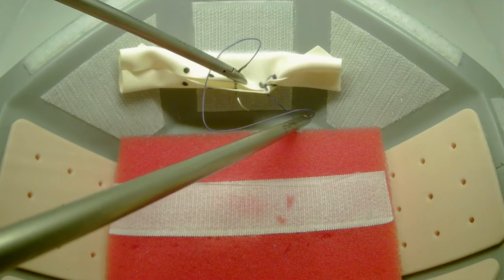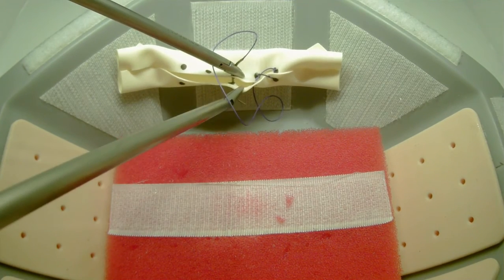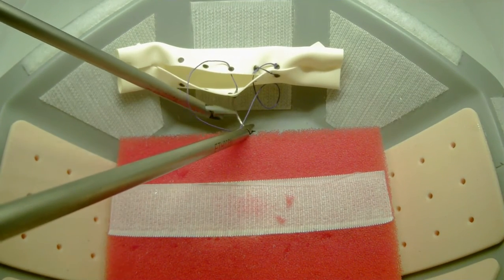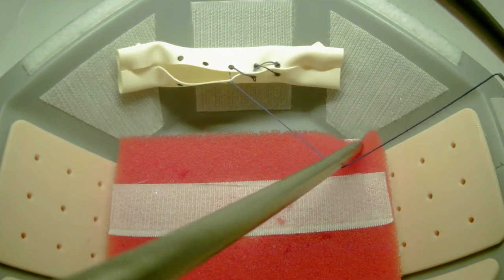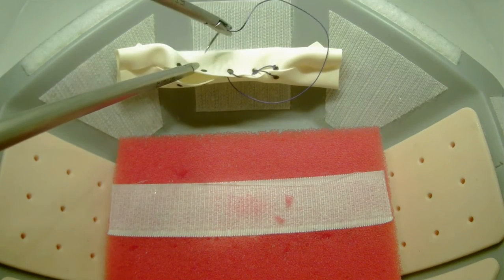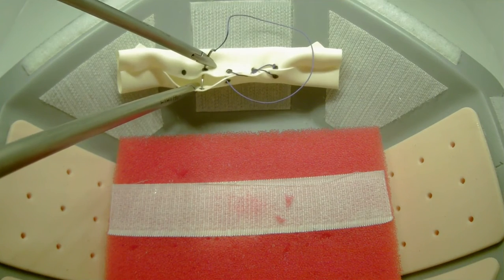You will want to make sure that there are no loops of suture between the marks. You may also utilize the suture block inside the lap bowl for assistance.